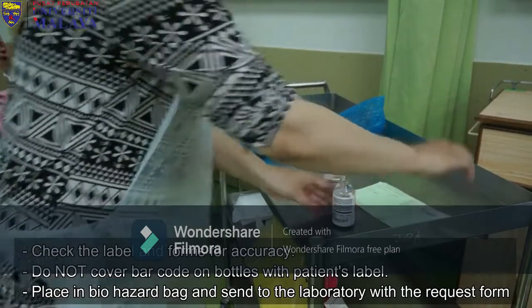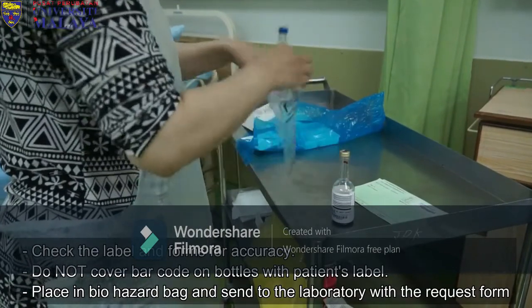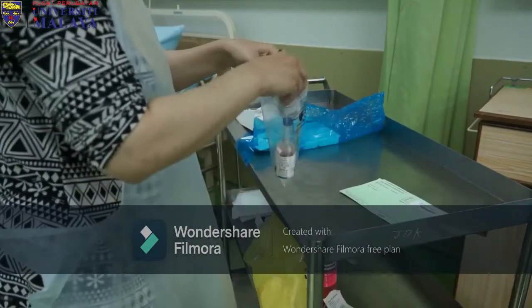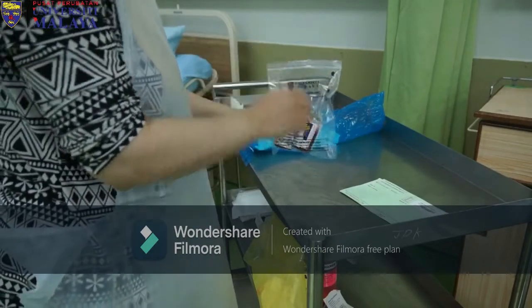Check the label and form. Do not cover the barcode on the bottles. Place in a biohazard bag and send to the laboratory with the request form.